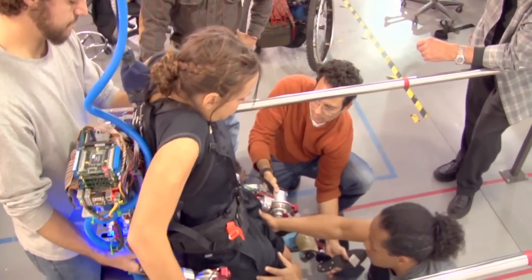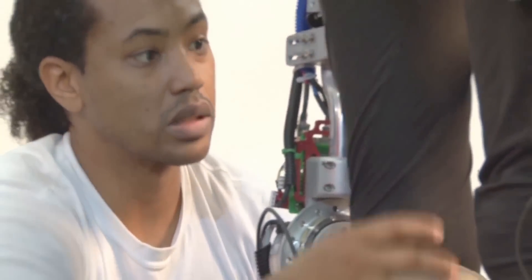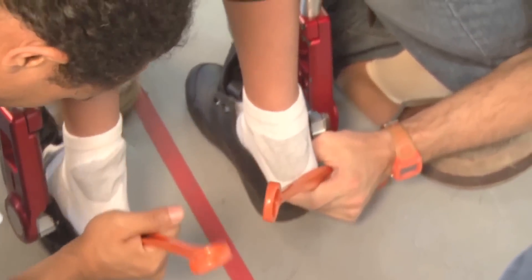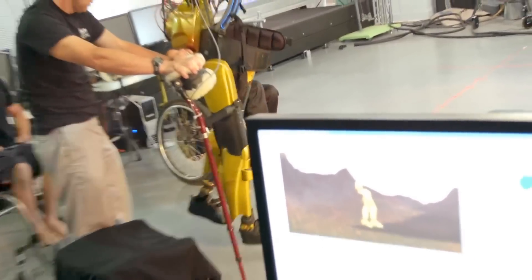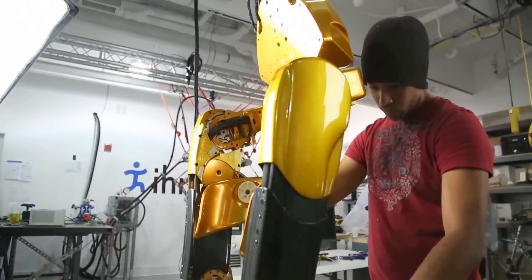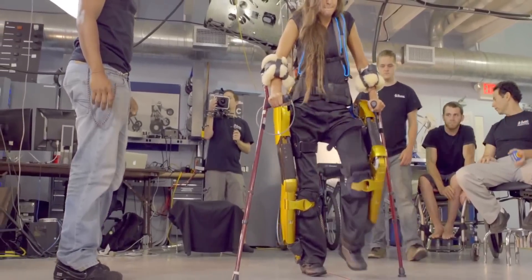After doing our research with that robot, we realized we needed to make some advances so that we could do more significant research. In our collaboration with NASA Johnson Space Center, we designed a robot called the X1 exoskeleton, which also has motors at the hips and the knees.